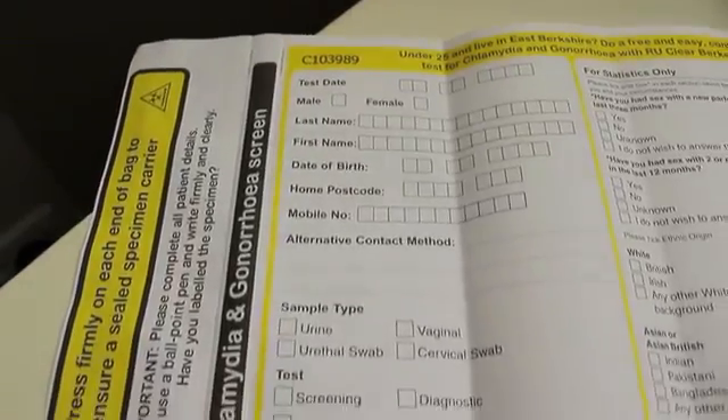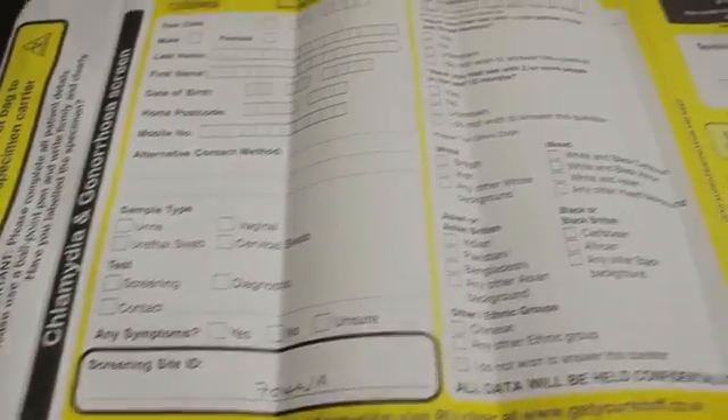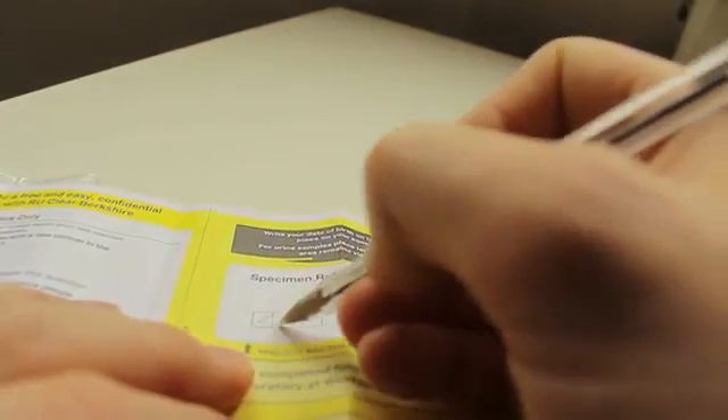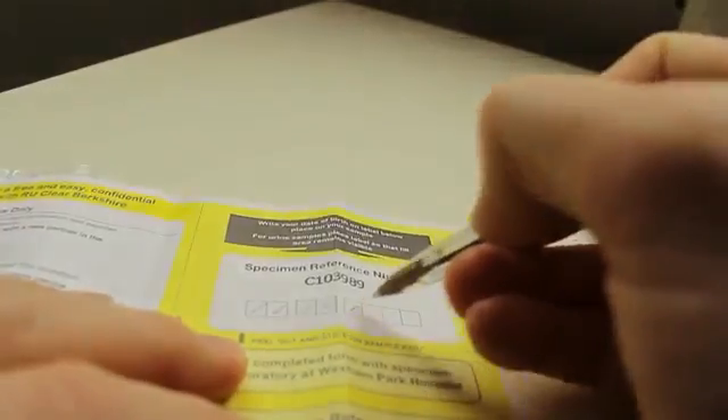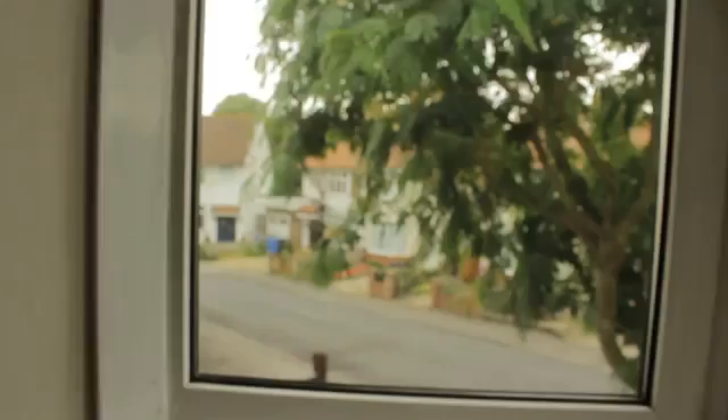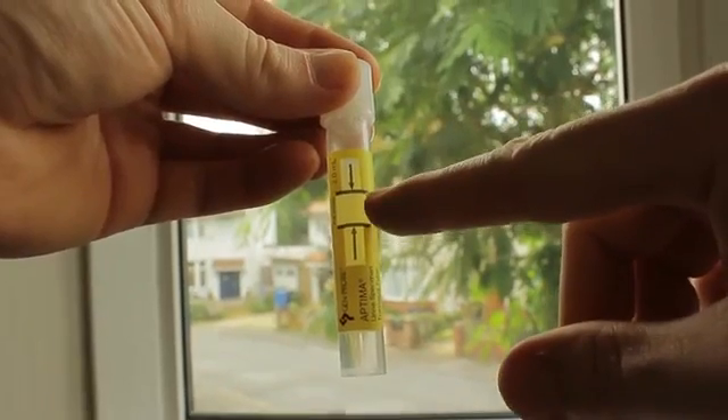Now we need the information sheet. With this part, you just fill in the details — name, date of birth, address, that sort of thing. But remember, this is still confidential and your details won't be released to anybody else. On this removable sticker to the right of the page, you need to put your date of birth. Once you've taken the sticker off, you need to stick it on the test tube sample. But do remember, you must keep the black lines clear.